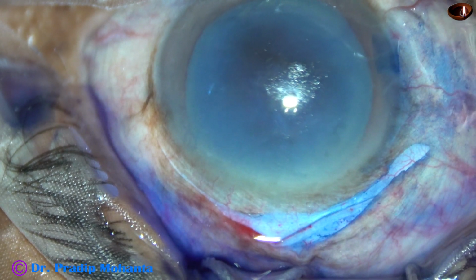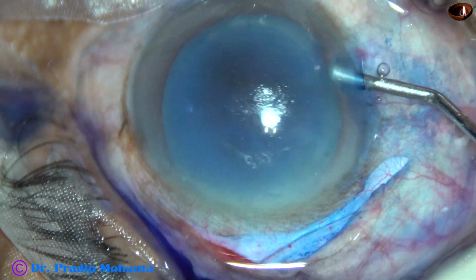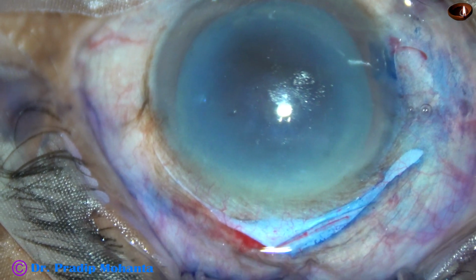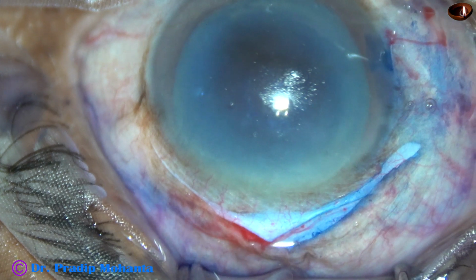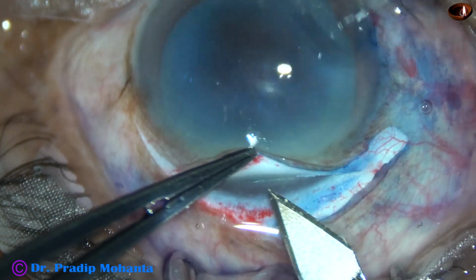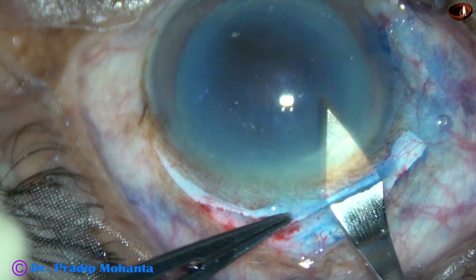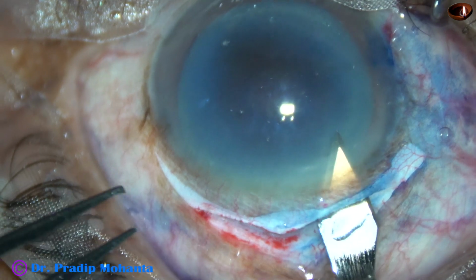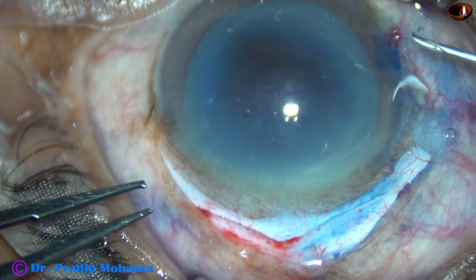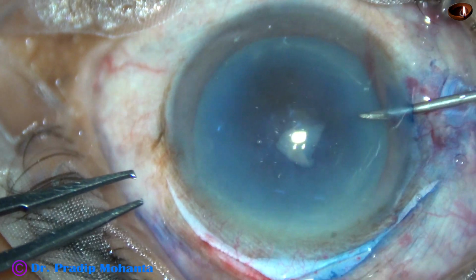Injected dye over the anterior capsule, washed it out, and now the anterior chamber is filled up with 2% HPMC. Now I am entering into the anterior chamber with a keratome and opening the right corner of the tunnel. And this opening I will use for capsulorhexis. I make a puncture, and milky fluid comes out.